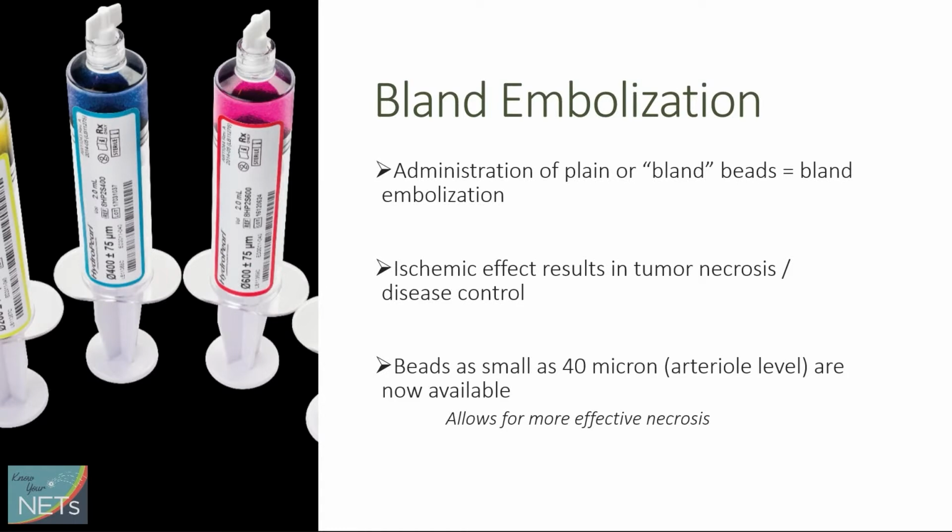The reason we like doing bland embolization with NET patients is because we get what's called an ischemic effect. Because the tumors in NET get a lot of blood supply, if we can shut all these blood vessels down, we can use really, really small particle beads.